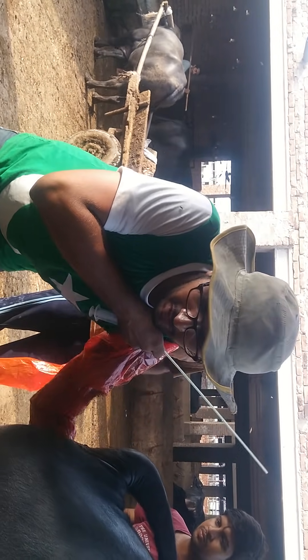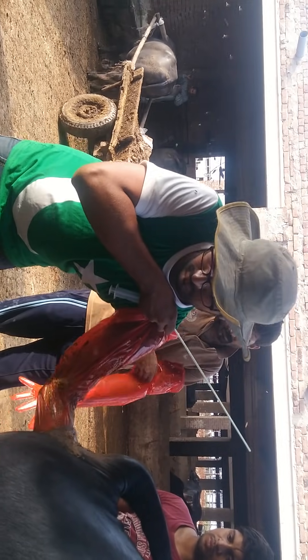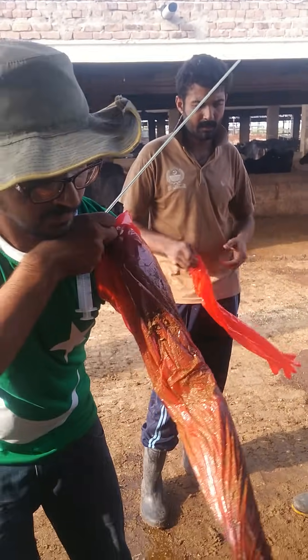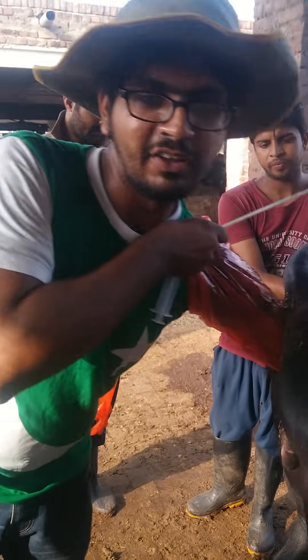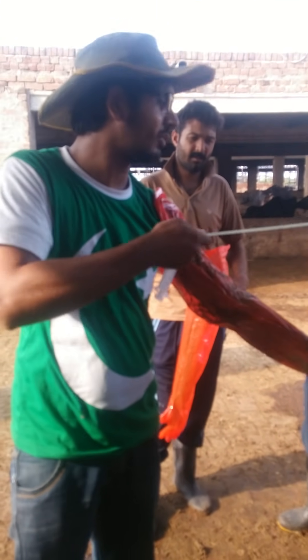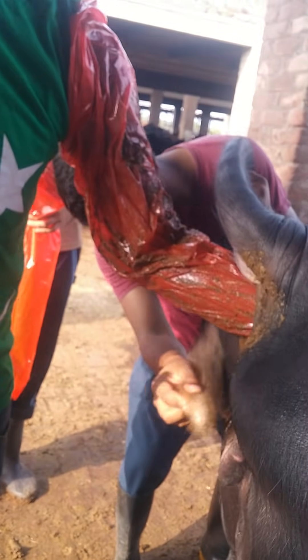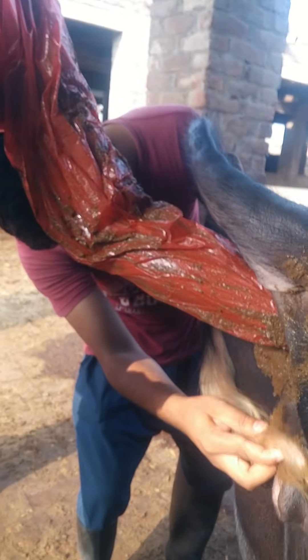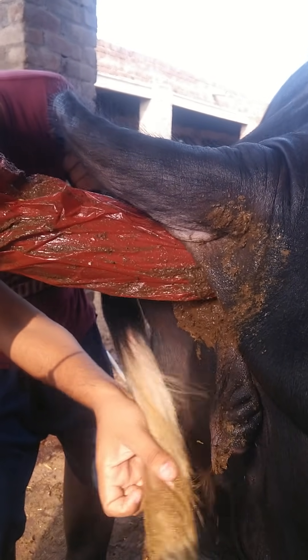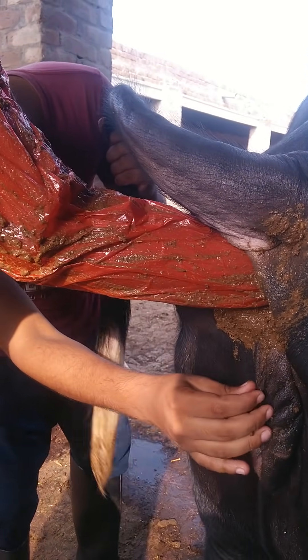The second most important step is the cleaning of the external genitalia. You can use tissue paper. You can also use the tail of the animal to hold it aside. If that is not serving the purpose, you can use empty bags as well.